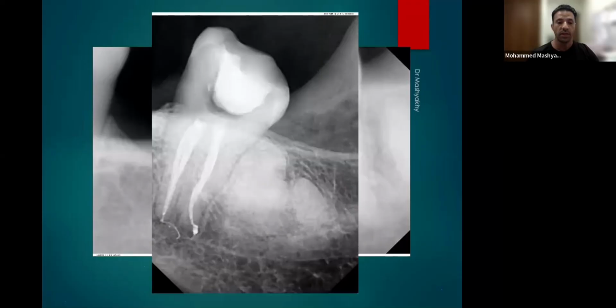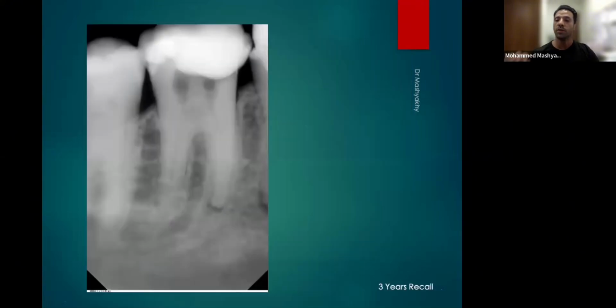This is how it looks from a different angle. You see the curve here. There is always a curve in the canal. Even if you see it or you don't see it, there is always a curve. So every tooth, you treat it as having a curve, okay?